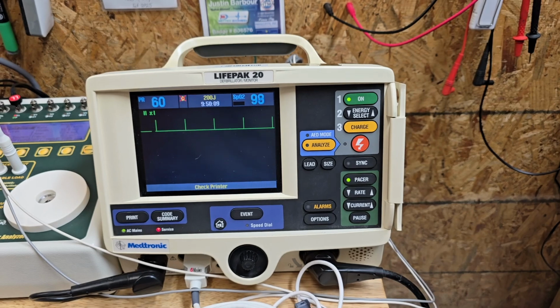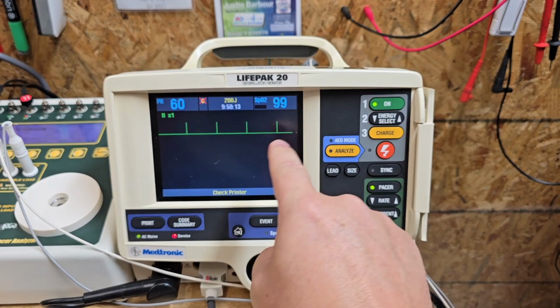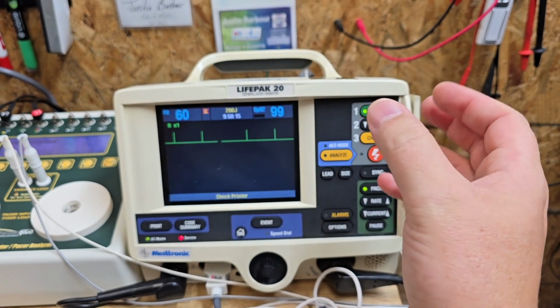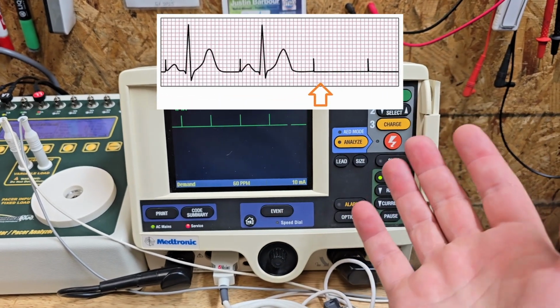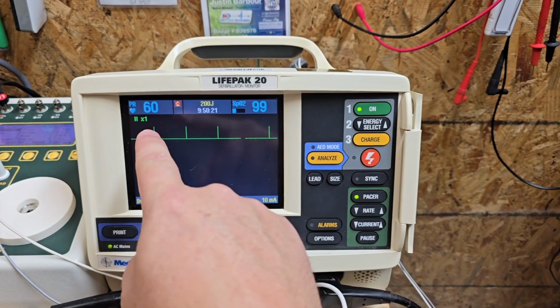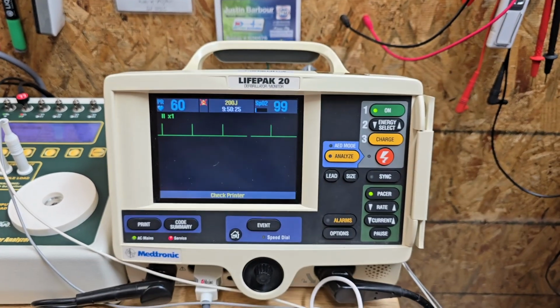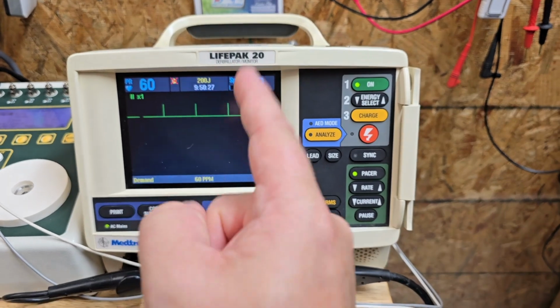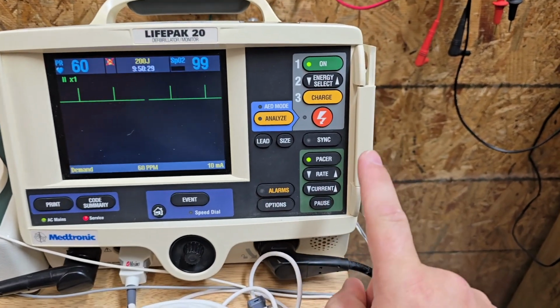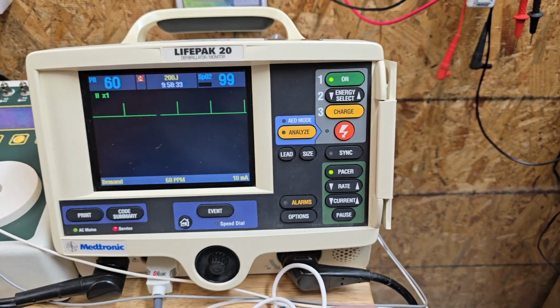But if it's asynchronous, that means I don't care what that patient is doing. We are going to get him going, because sometimes with patients their heart is failing. So yeah, it's working one moment, then the next moment it's not. So we're going to put him on a regular cardio rhythm, and we're going to put that to asynchronous, which means I don't care what the patient's heart is doing. We are going to tell it when to beat. That's when you move over here, go into asynchronous, and set that up.